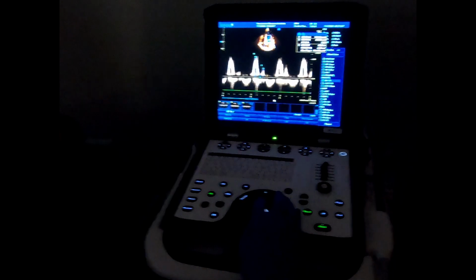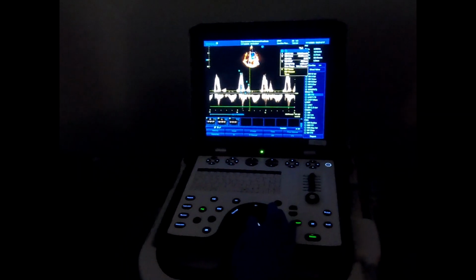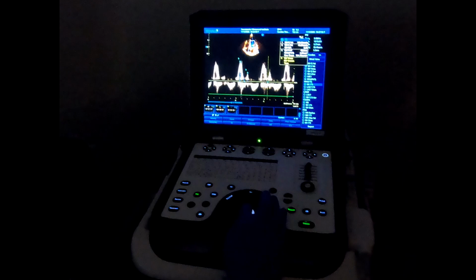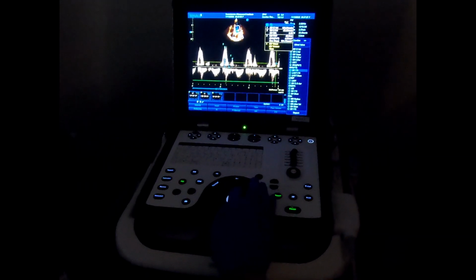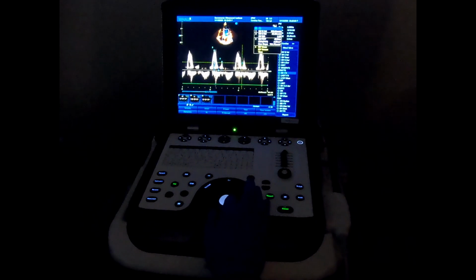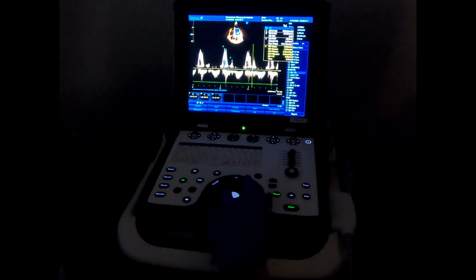And then for the A duration, if this A is not good, I'm just saying it as an example, you need to have a good A like this to see the duration. If this duration is not good, you can measure as long as you're measuring the following beat, but not after 3-4 beats. Or instead you can select this one and do all the measurement here, and also measure the A duration.